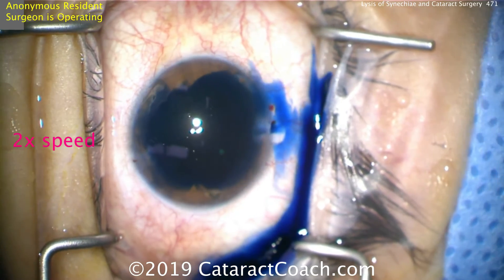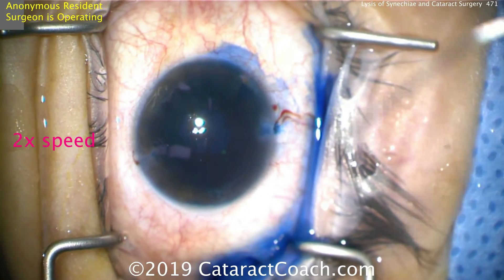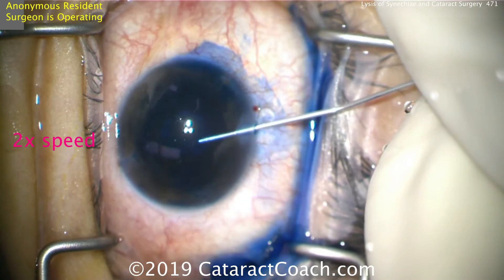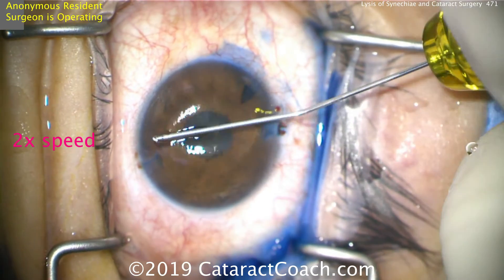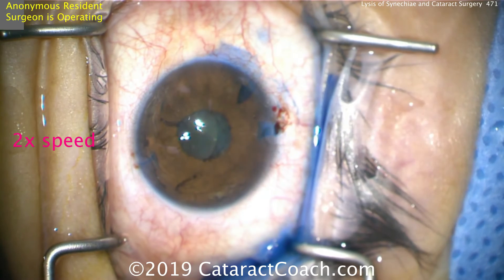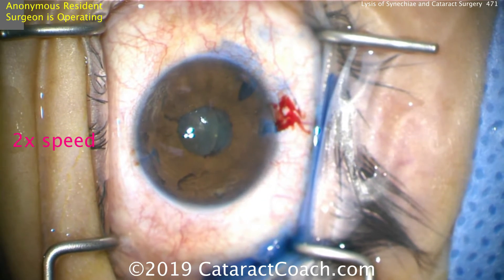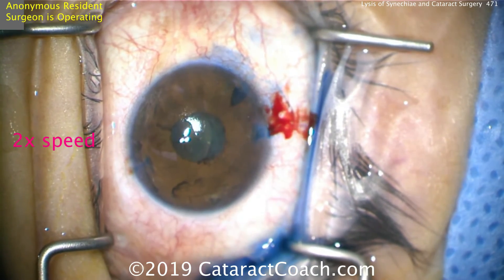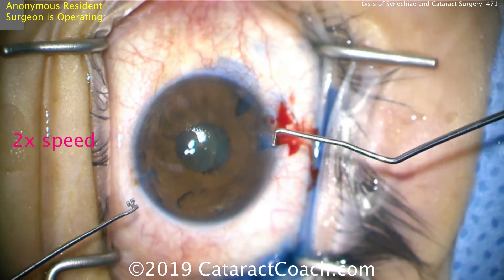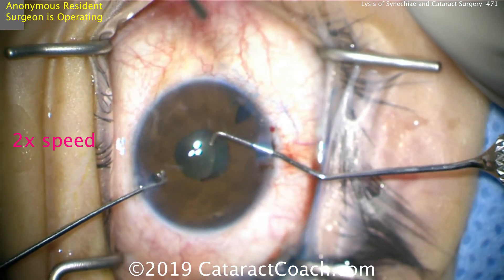Now, could you fill the eye with viscoelastic, then expand the pupil, and then stain it? Yes, but then you have to evacuate out the viscoelastic, because the viscoelastic may prevent the TriPen Blue dye from adhering or staining the anterior lens capsule — particularly when using a dispersive coating of viscoelastic. So now we have an eye about 70% full of viscoelastic, keeping the pressure relatively low. Using two instruments, we're doing a pupil stretch.